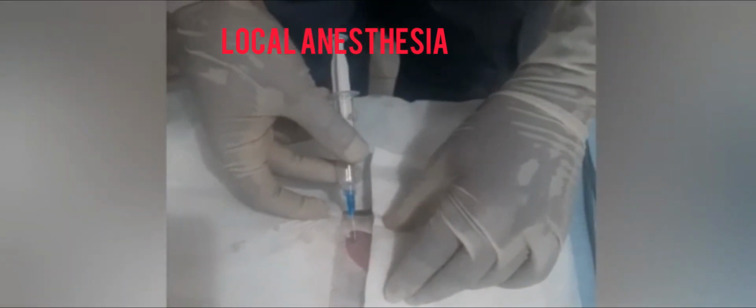Then carefully put the syringe to the area where you want to anesthetize. Put the needle on the outer surface of the tissue and then go deep. Carefully put the drug. Make sure you cover all the surface, all the area you want to anesthetize.